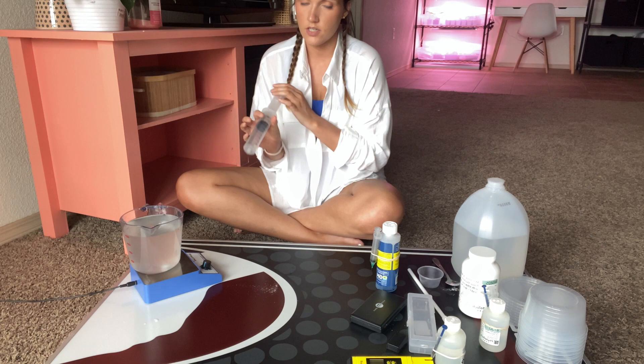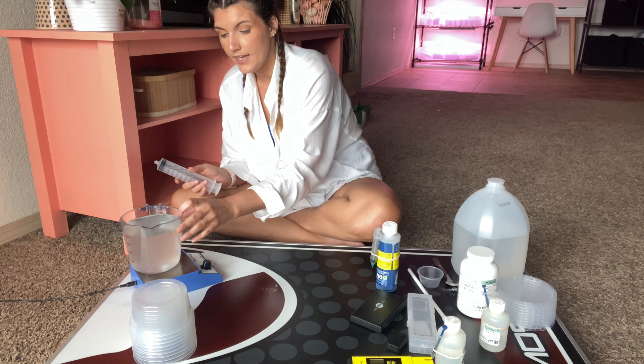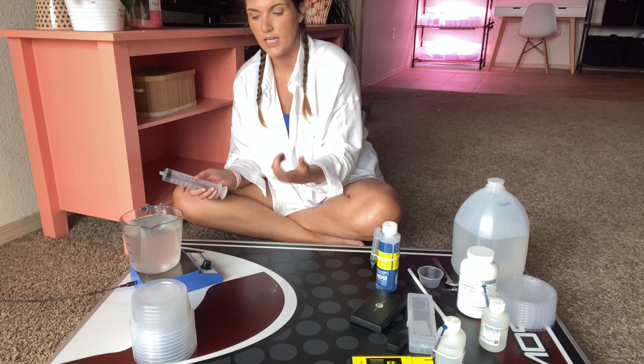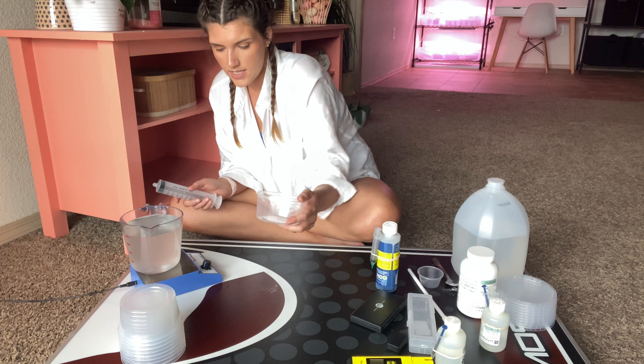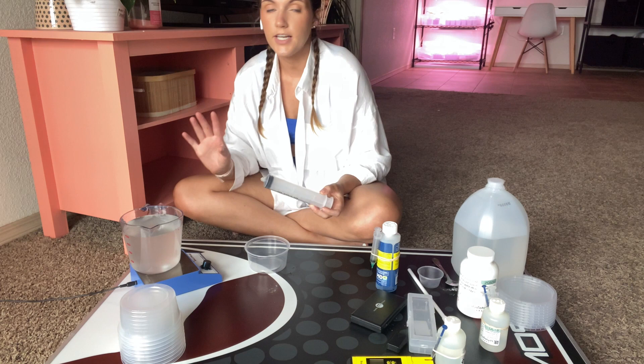Now I'm going to start dispensing. To dispense I like these giant 100 milliliter syringes, which is exactly how much media I put into each of my containers. Since I'm doing a liter, I can get 10 containers with 100 milliliters per container. I do like to leave my magnetic stirrer running while I'm dispensing the media into the containers because it'll keep everything mixed up. The first time I did this I didn't leave it running, and all of the agar settled to the very last container and I had to dump it all back in. So make sure you leave your magnetic stirrer running while you're dispensing.